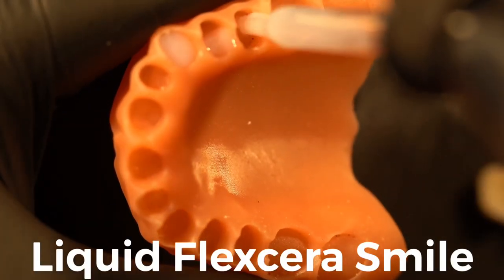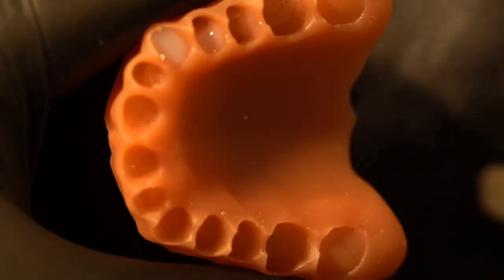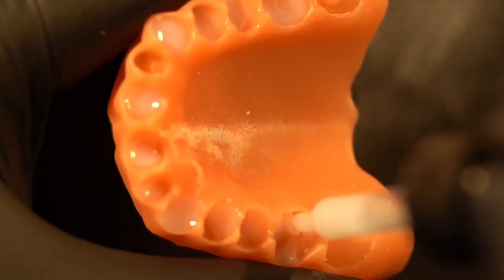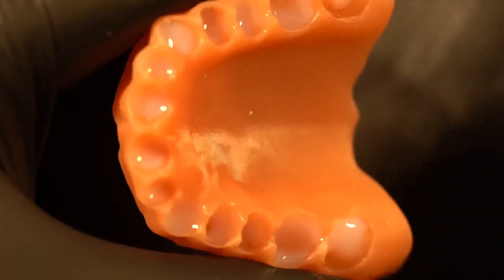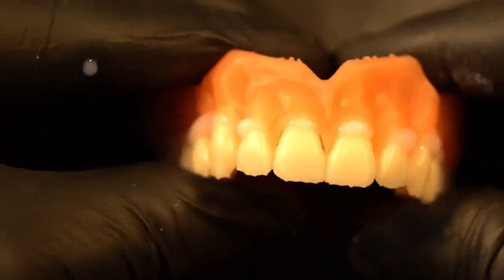We're going to go ahead and do our initial bonding here. I'm using an eyedropper in an amber glass jar so it doesn't cure the Flexera Smile Ultra Plus. I have Flexera Smile Ultra Plus and I'm dropping it into these tooth wells. It's important to note that the base has not been post-processed in the Otoflash yet, neither has the arch of teeth.